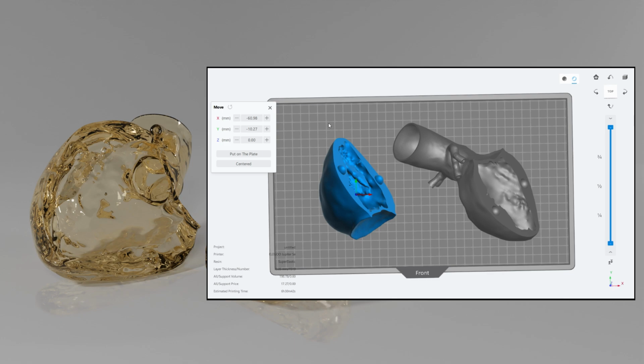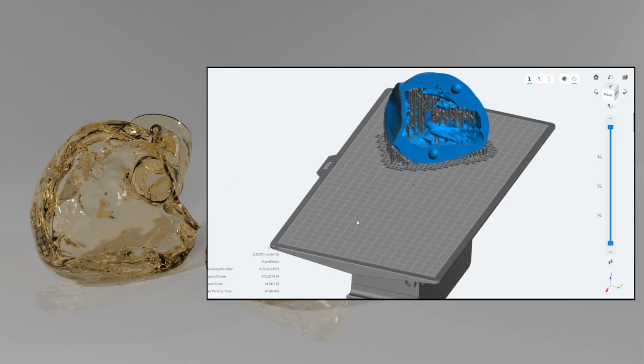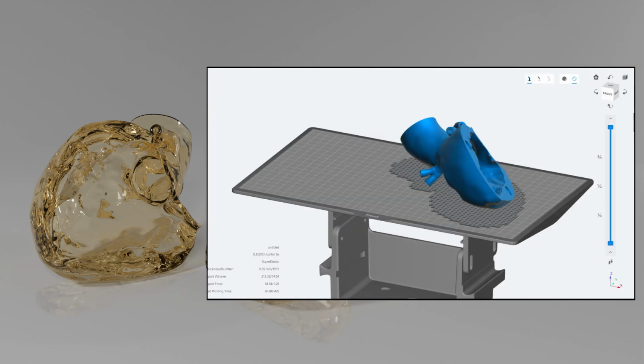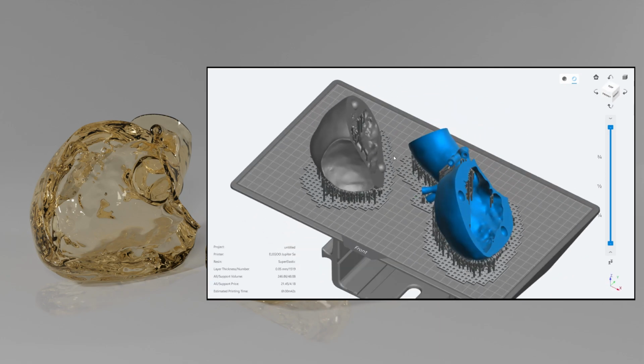In this case, we chose a resin that cures to a flexible material with a hardness of Shore A30. This material not only meets the surgeon's requirements for flexibility but also provides the durability needed for handling and testing.